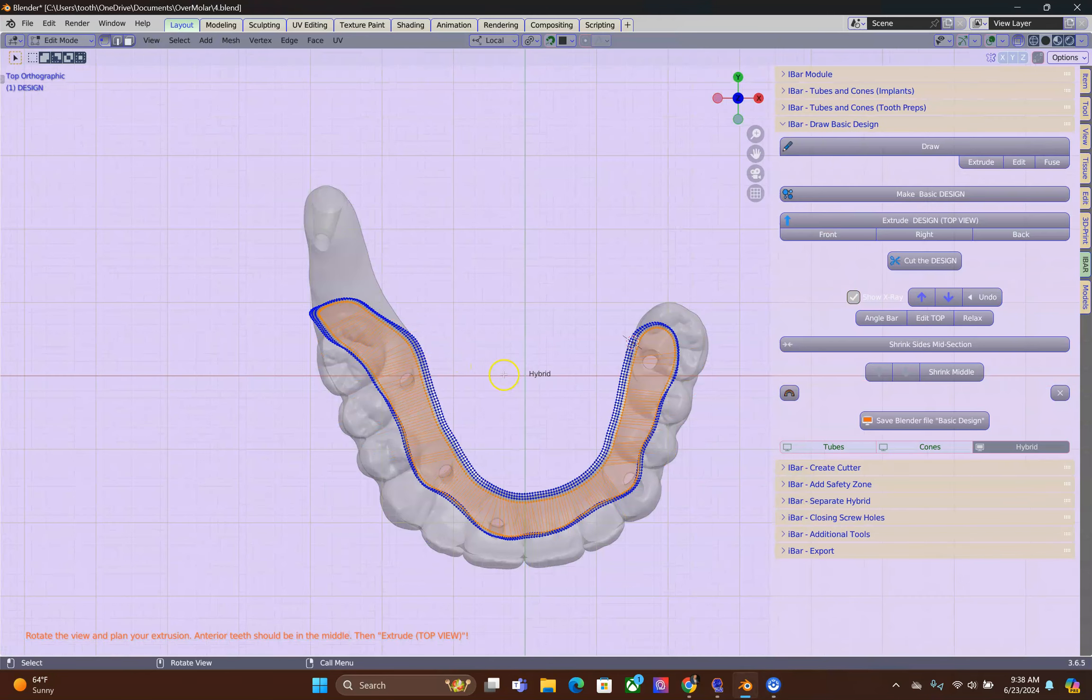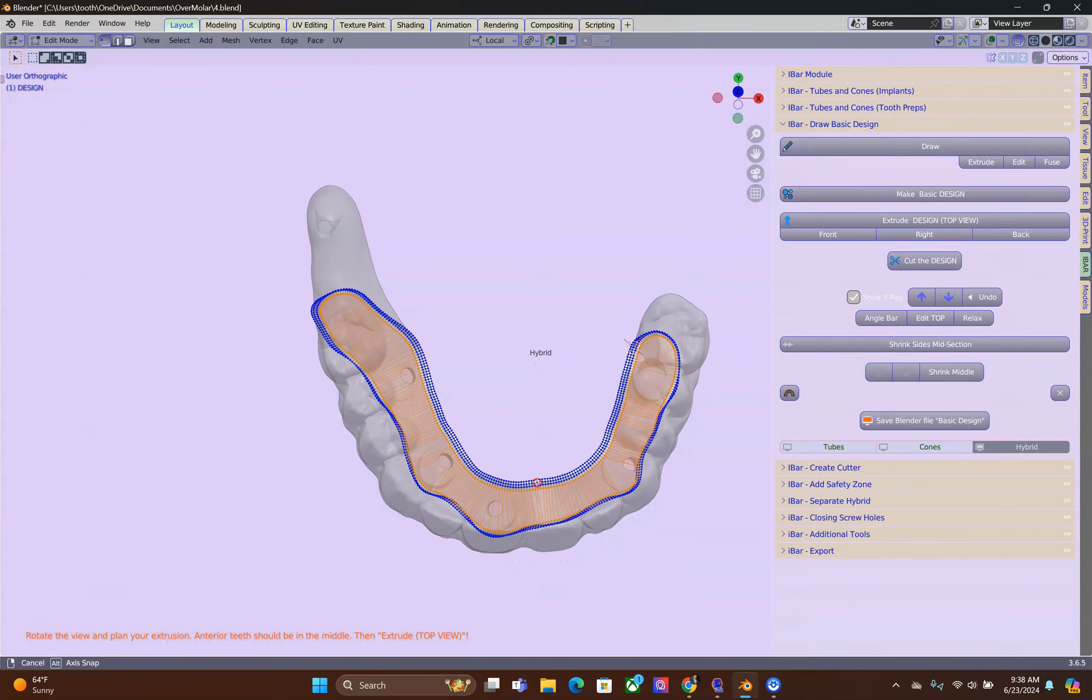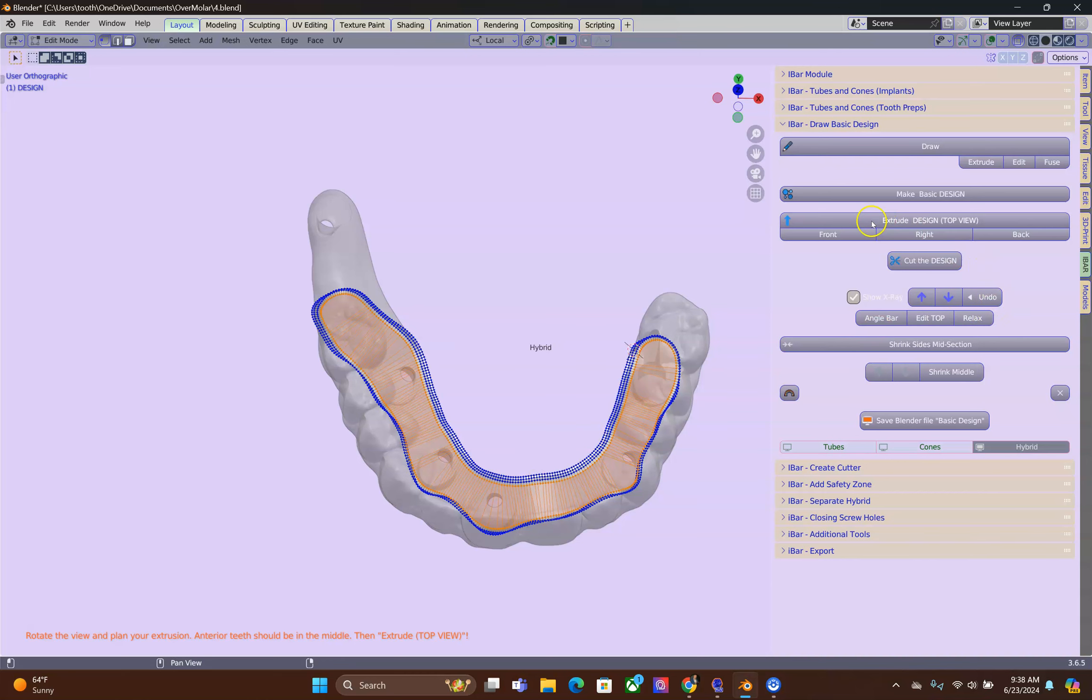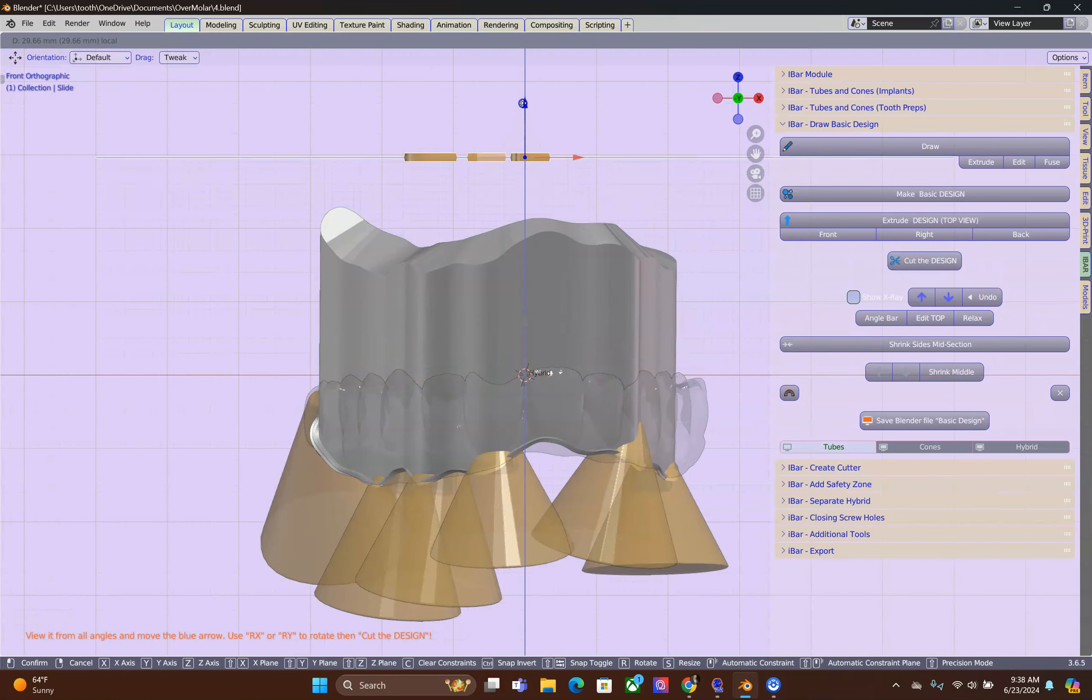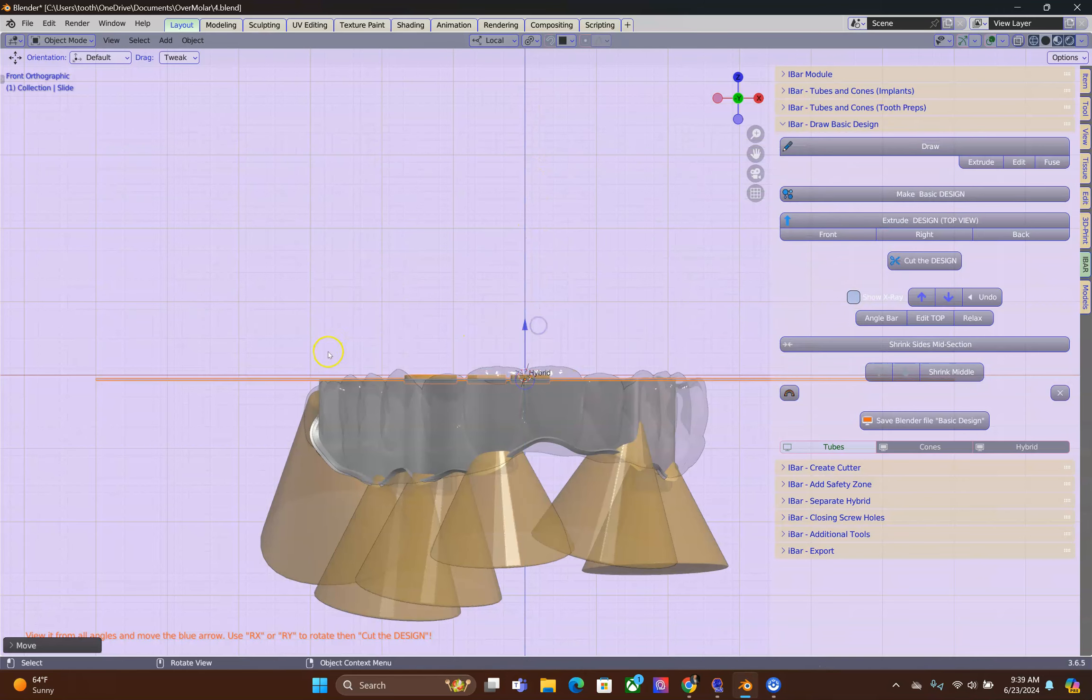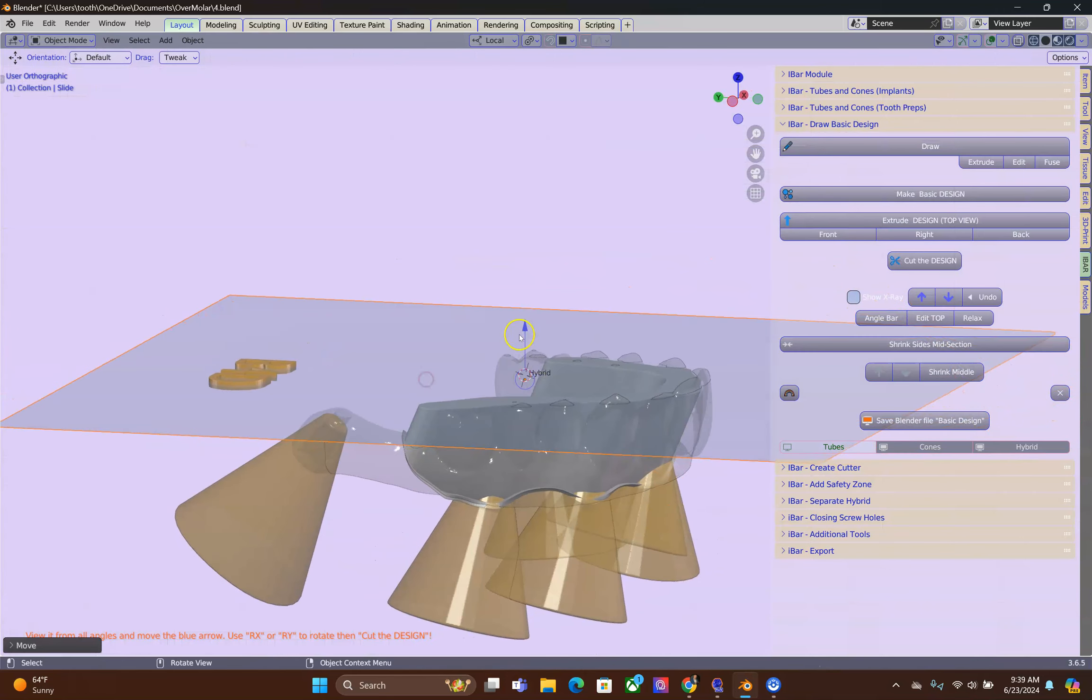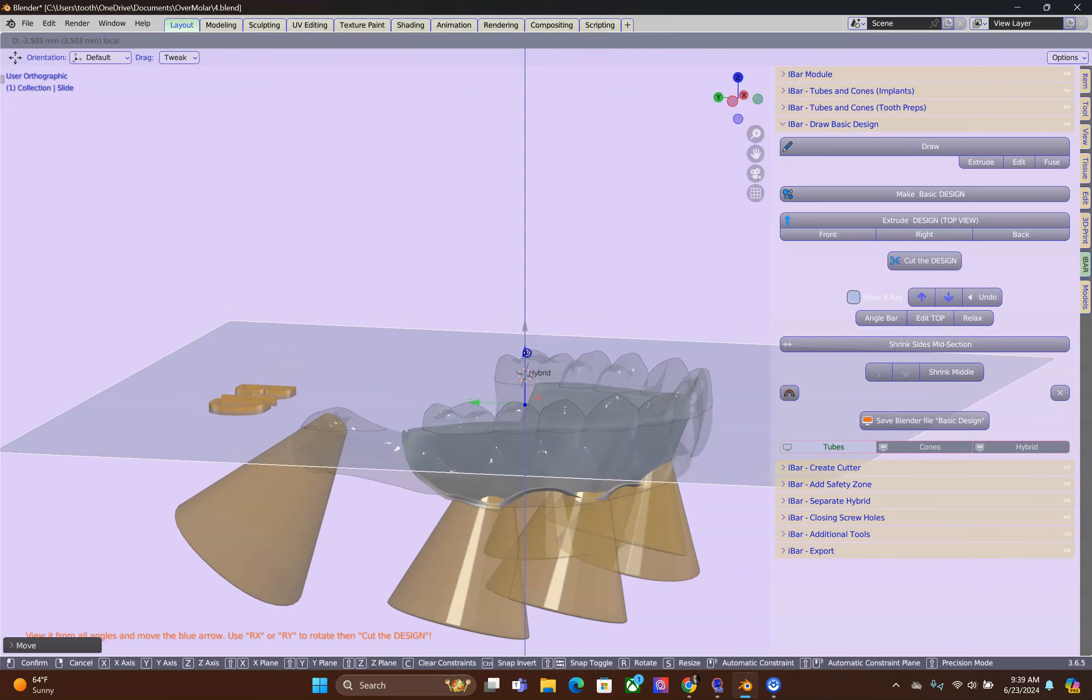We're looking at it from the top down. We're going to rotate the scene so that the silhouette of the front teeth is inside of the basic design. Okay, this is our cutting tool.